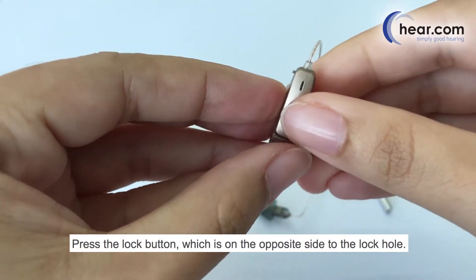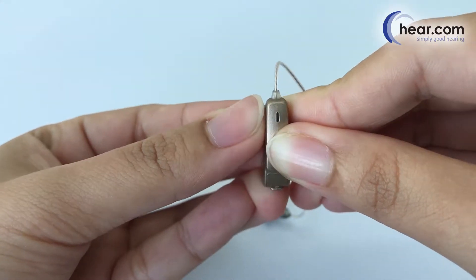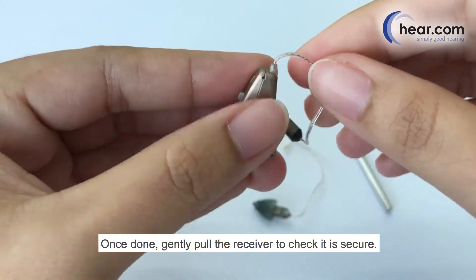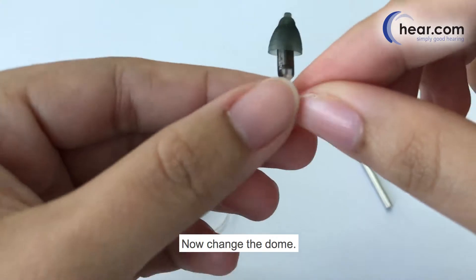Press the lock button, which is on the opposite side to the lock hole. Once done, gently pull the receiver to check it is secure. Now change the dome.